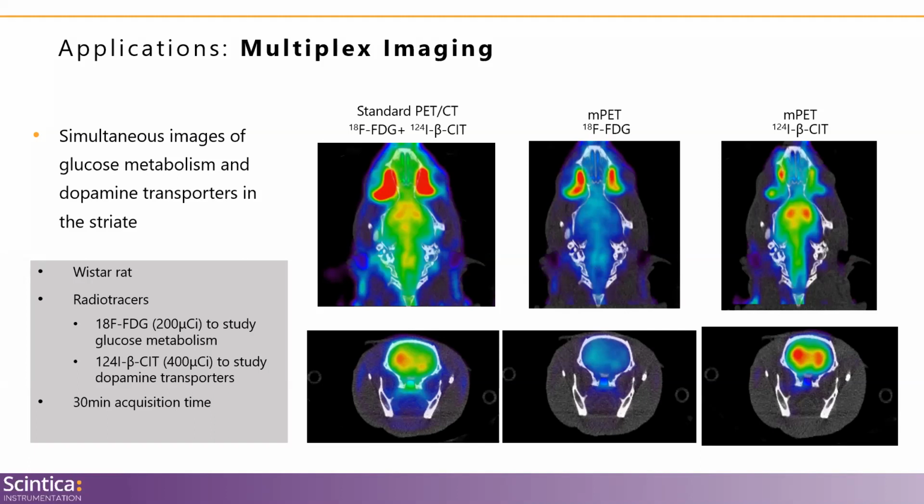And how this works, as I mentioned earlier when we were talking about PET, is that standard PET isotopes routinely emit 2 gamma rays during an annihilation event, but there are also some non-standard PET isotopes that emit 3 gamma rays. Depending on the system you're working with, you can actually separate out these signals to monitor 2 different biological processes at the same time.